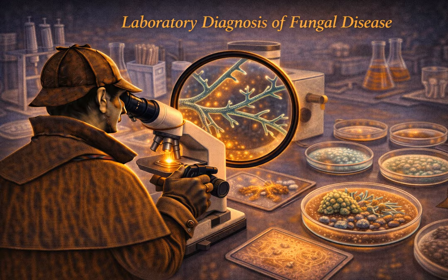Why don't we just use it on every single plate in the lab? Because of the cycloheximide trap. This is a massive exam alert and a real clinical pitfall. It turns out some of the most dangerous human pathogens are also sensitive to cycloheximide. We are accidentally poisoning our own witness. Exactly. If you only use media with cycloheximide, you will kill the very thing you are desperately trying to diagnose.